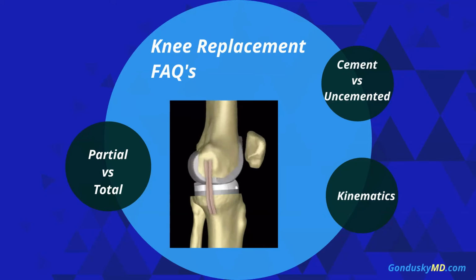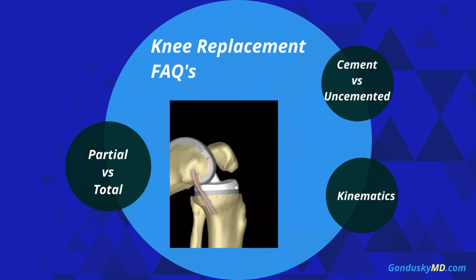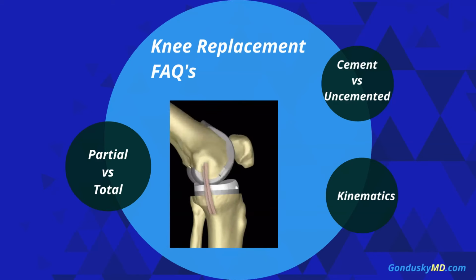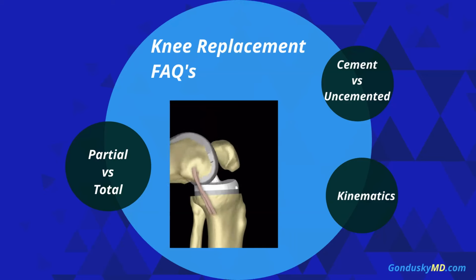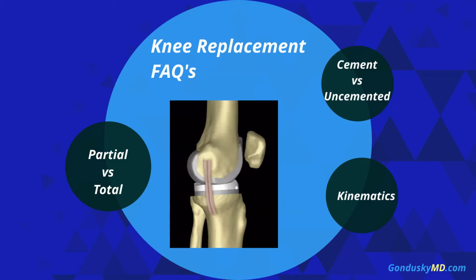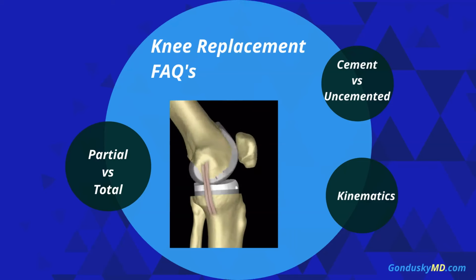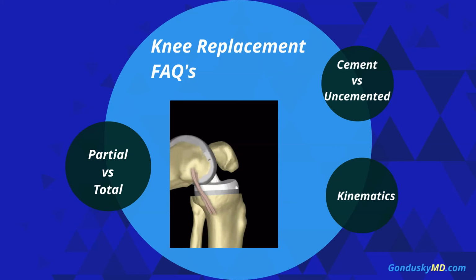But the kinematic aspect that I'll talk about, I think, is what really differentiates the ability of younger people to do more active things successfully without pain and without swelling. And that does have to do a little bit with the specific implant we choose and the stability we can get with that implant. So we'll talk about that in a little bit.